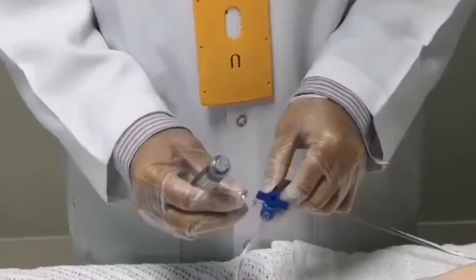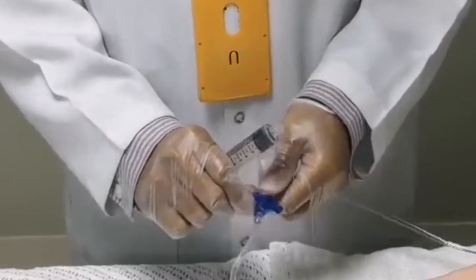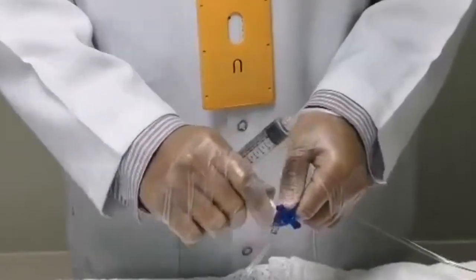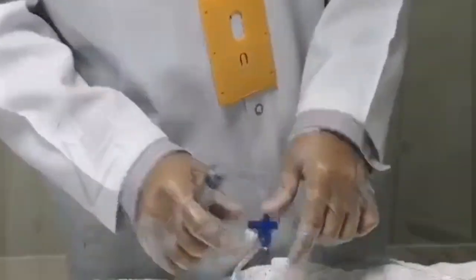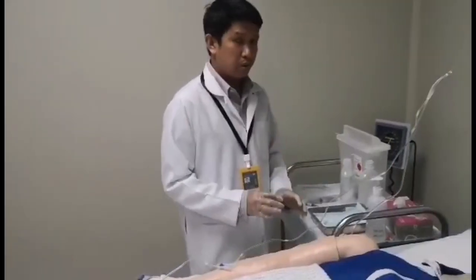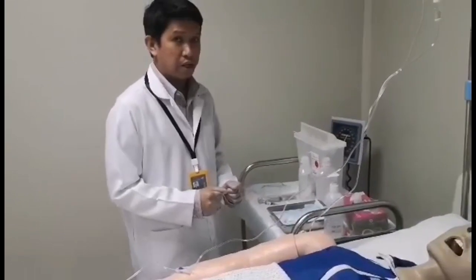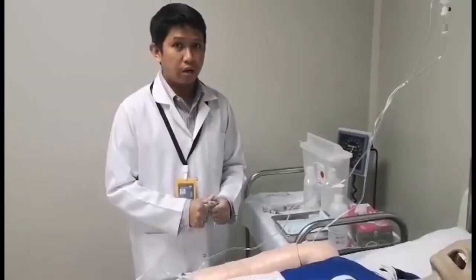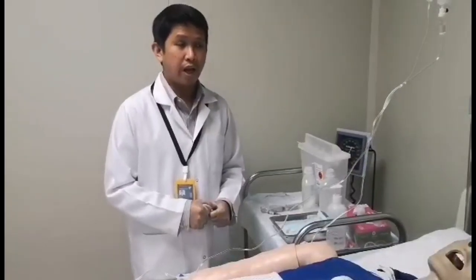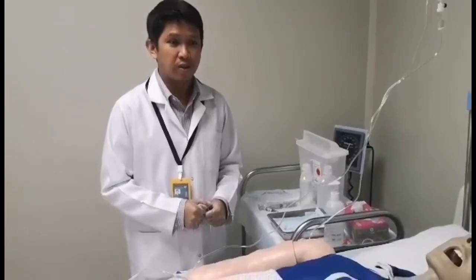Close the saline lock and recap the injection port. Dispose of the used equipment as per agency policy, document the nursing procedure, and evaluate the patient's response to medication.